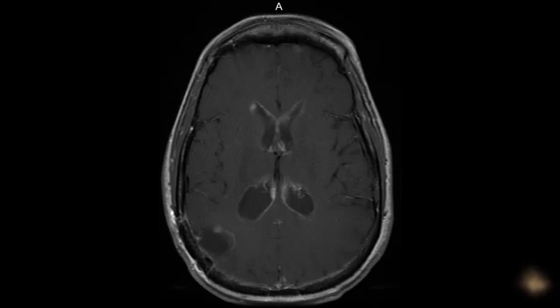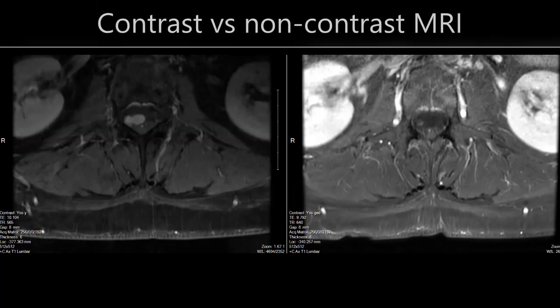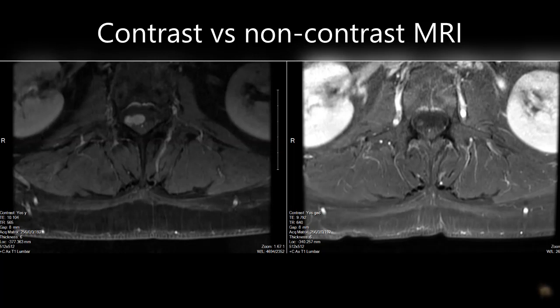These brain images show enhancement in the ventricles and some areas of the meninges of the brain when contrast was used. The following are a different view of the spine with and without contrast.